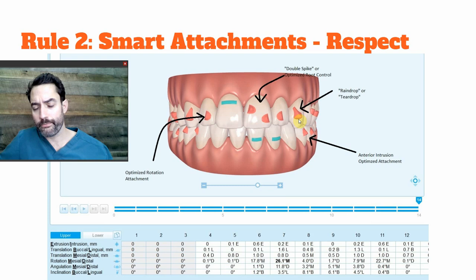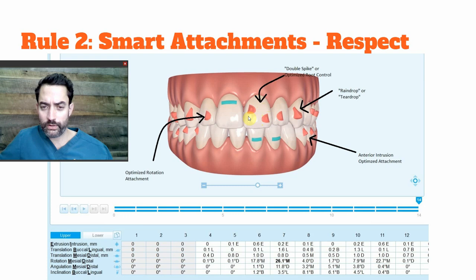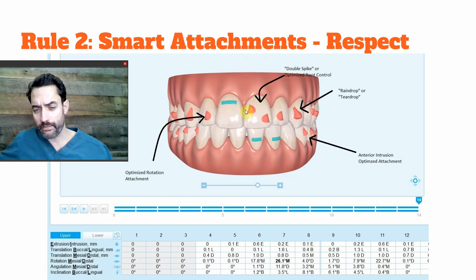The double spike attachment relates to root torquing. If a tooth shows, say, a 5.1-degree mesial tip torque, you need to verify that's actually required. If I'm tipping the crown mesially I'm torquing the root distally — or in this case, a mesial root torque that seems completely unnecessary. I would double-click, zero it out, see if that's a better treatment plan, and then remove the double spike. These are abstract concepts that take practice.